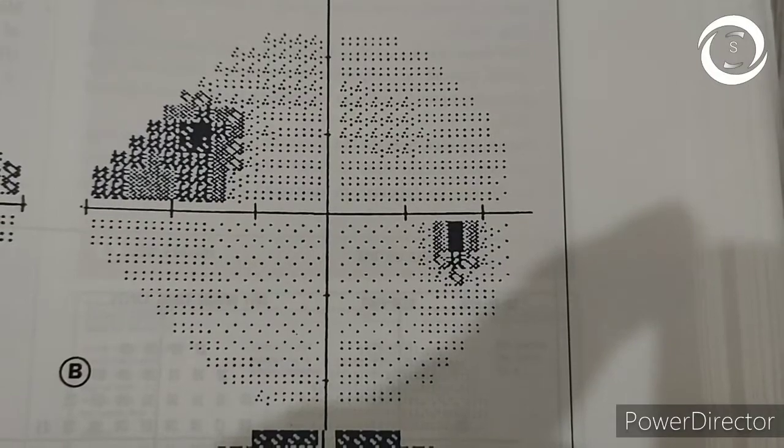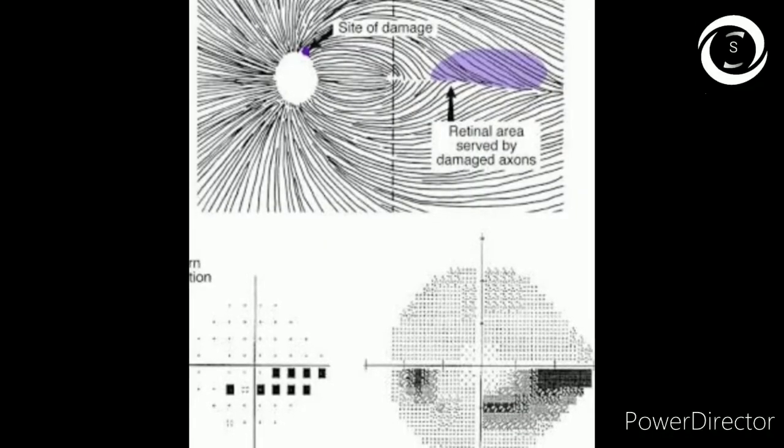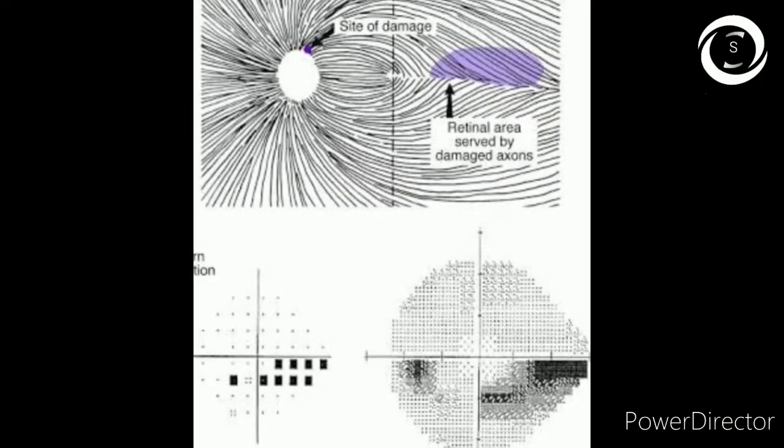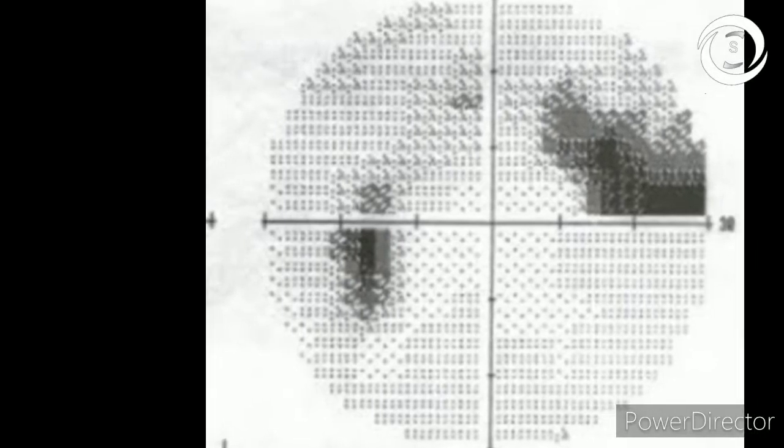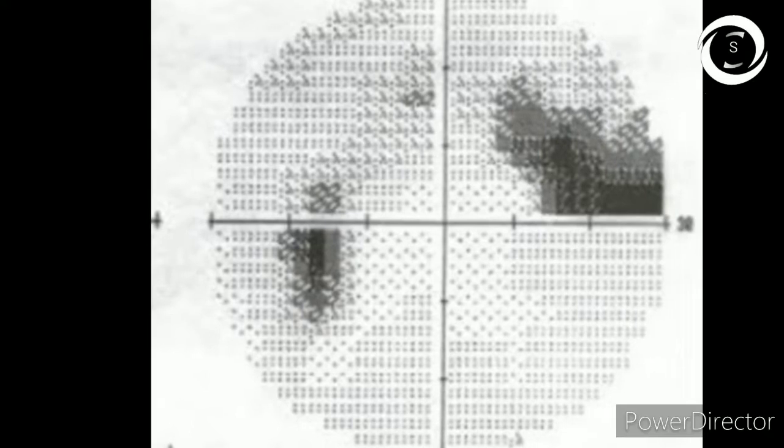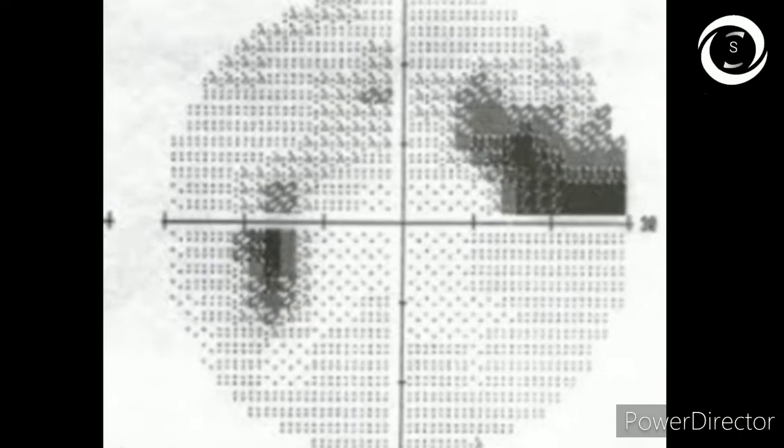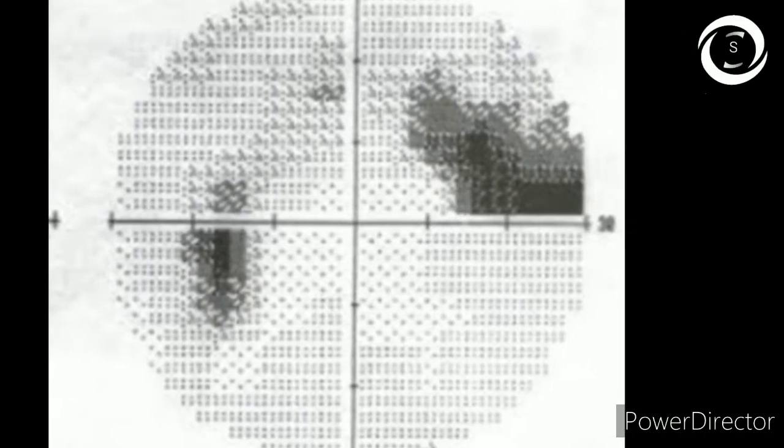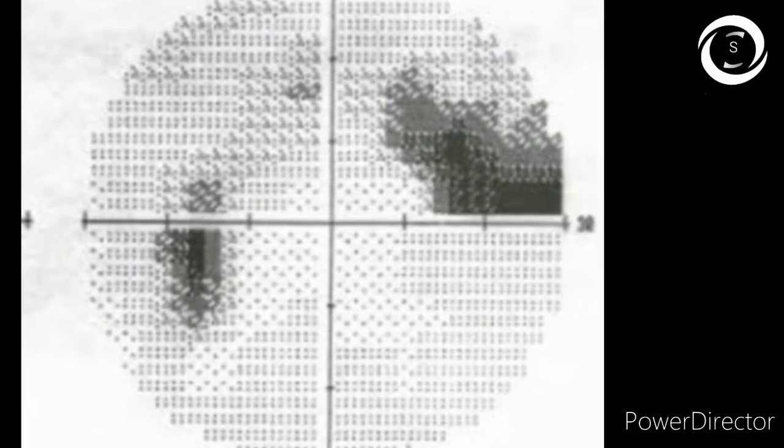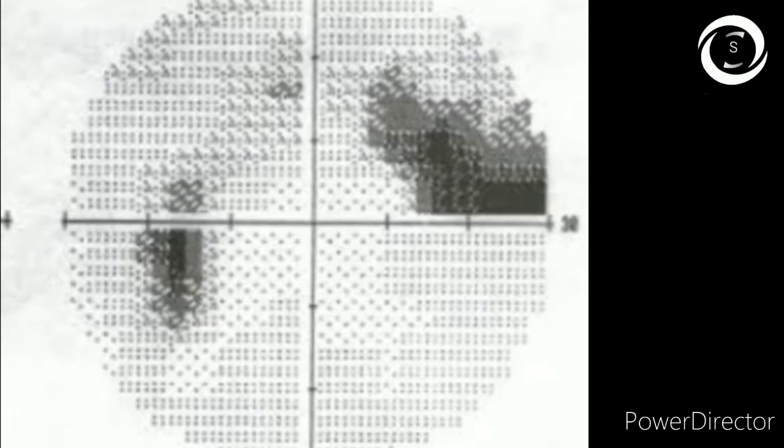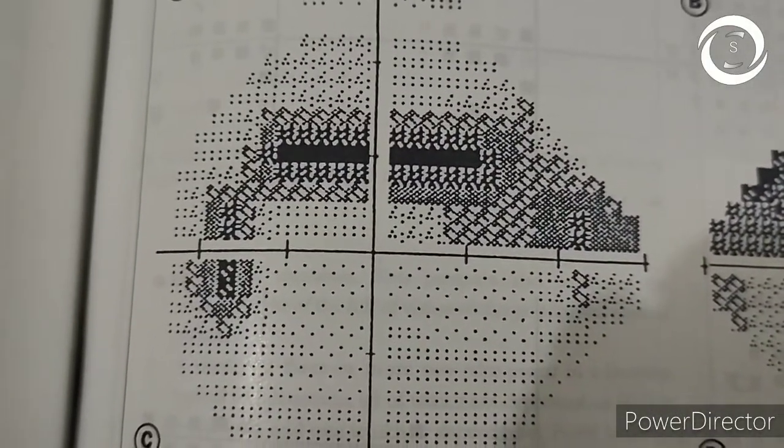As visual fields deteriorate in glaucoma, more paracentral defects are formed. When the paracentral scotomas coalesce with the blind spot, that is called sedal scotoma. Look at this visual field: blind spot on the left side below horizontal meridian and joined by the paracentral scotoma above horizontal meridian. You can also appreciate the enlarging nasal step on the other side joining with nasal paracentral scotoma. This has got sedal and nasal step.